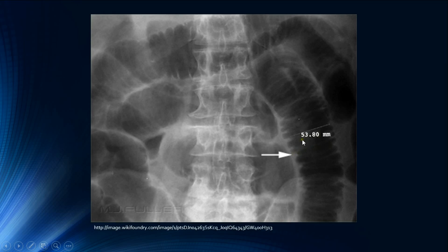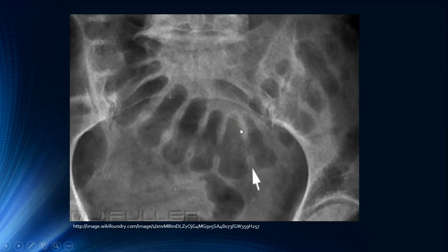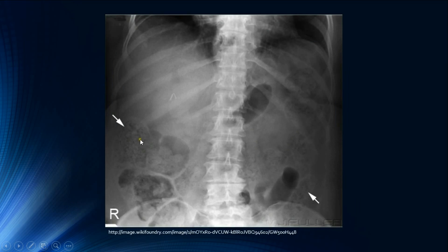This example shows small bowel measuring approximately 5.4 cm, confirming dilatation. The large bowel has haustral folds that do not traverse the full diameter. Its normal diameter is less than 6 cm, except the cecum which is normally less than 9 cm. The large bowel is peripheral in location, and fecal material — found only in the large bowel — helps confirm identification.